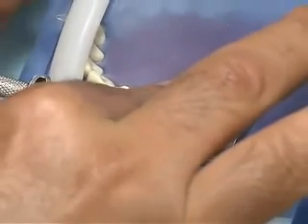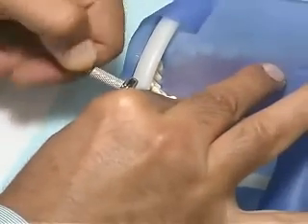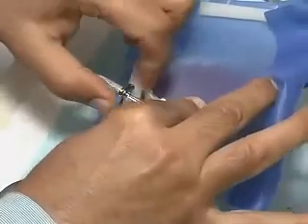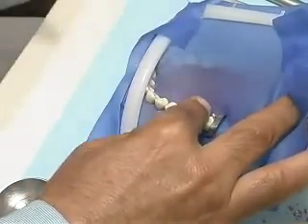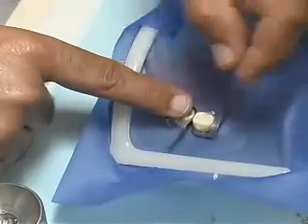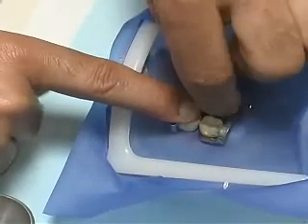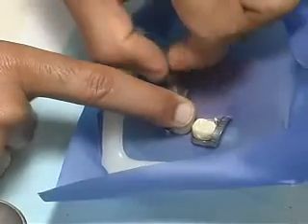Holding the band in place with your finger, unscrew the matrix retainer and remove it from the band. Carefully remove the band from the tooth except at the proximal surface that is being restored. Fold the band back away from the tooth at this area.